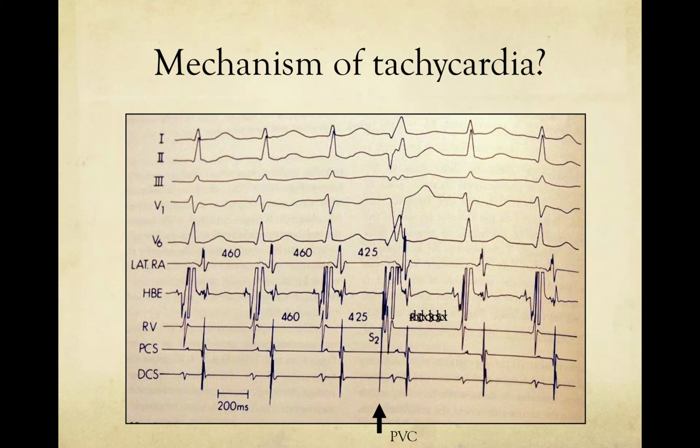when we place the His catheter, we inadvertently bang it and cause some transient AV nodal slowing. This is one of the really big frustrations for electrophysiologists, that sometimes just by placing your diagnostic catheters, if you just happen to push a little too hard in one area, you can get transient AV block or transient AV slowing or prolongation. And then you're really in deep trouble because you can't actually induce SVT, or you can only get single beats of it, and that makes the case very difficult.